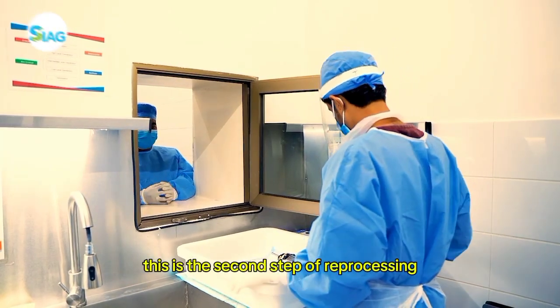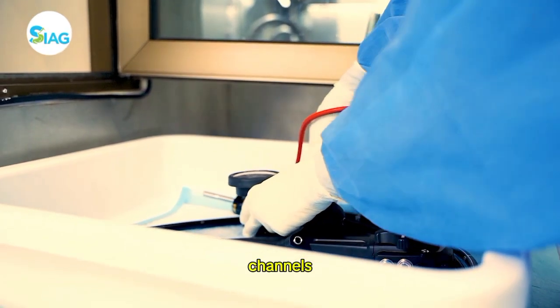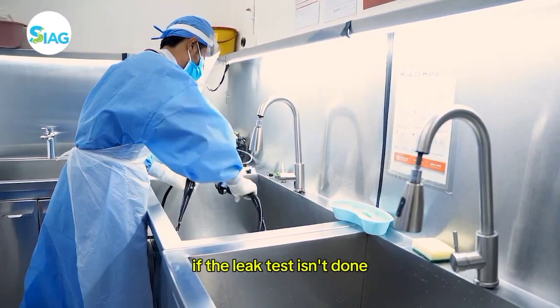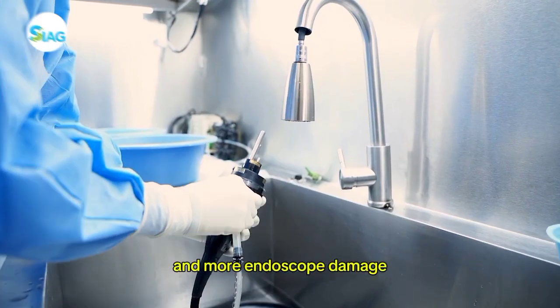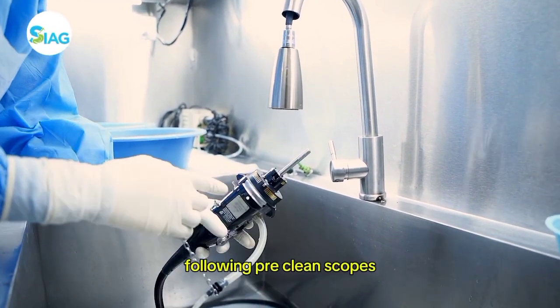This is the second step of reprocessing. You can find any damage to the scope's internal channels and external surface by performing a leak test. If the leak test isn't done and there is internal damage in the scope, this might result in insufficient disinfection and more endoscope damage. Leak testing must be done immediately following pre-cleaning of the scopes.